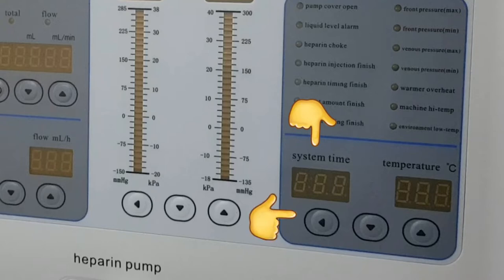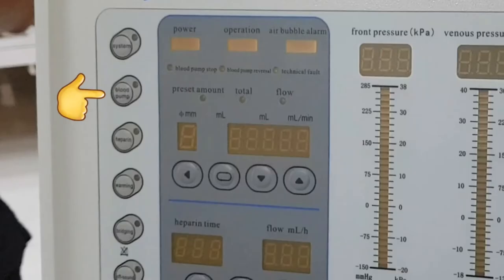Blood pump: setting the blood flow rate can be done in this part, and the process is the same as setting the system time. There is also a setting for the diameter size of the bloodline, which can be found in its package — either 6 or 8 millimeters. For this machine, the diameter is already fixed and the default size is 8 mm. The center part, as discussed from the lecture, is not used, so I'm not sure what it's for.